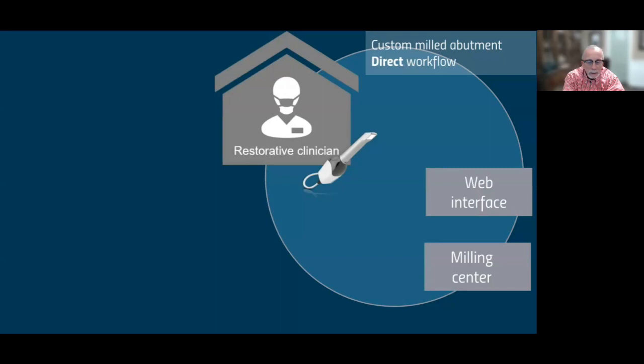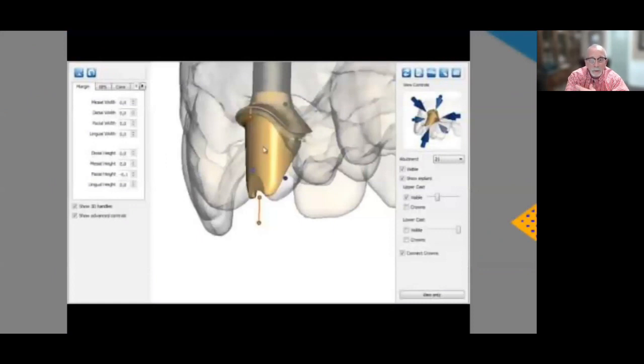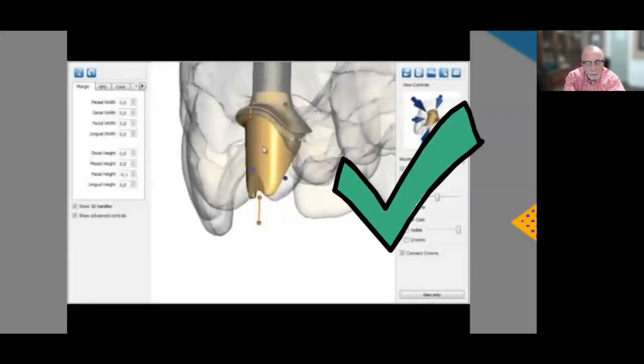Now, the second method that a dentist could do is say, look, I've got an intraoral scanner, but I have no interest in designing and milling and doing all that. So I want to scan it, but I want to send it out somewhere. And there's two paths, right? So this first path is that the clinician could scan it and send it to an abutment manufacturer somewhere and say, hey, I need an abutment, and pay them to design it, right? They would design it, and they would send the design back to the clinician. So you got to have the software, and you got to have the time, and you got to check your email a lot to know that, okay, your design's here, come approve it, because they won't mail it without approval. So you got to check the boxes, right? And you got to be willing, and you want to do that.